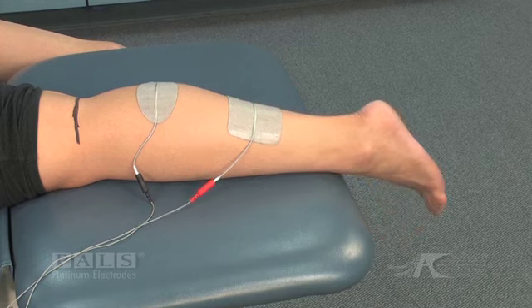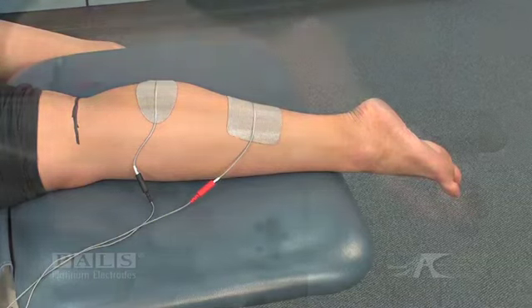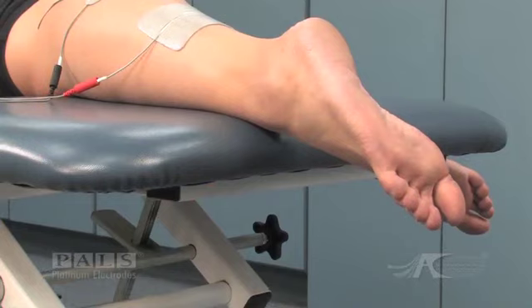During stimulation, active plantar flexion occurs, but because this subject is not weight bearing, it would have to be graded 2 out of 5.